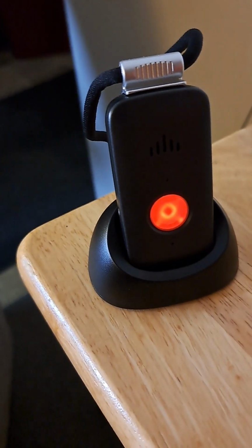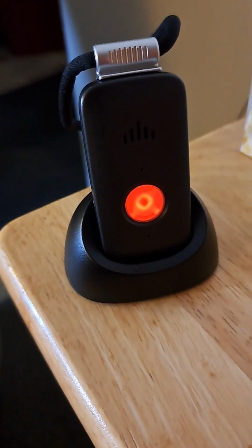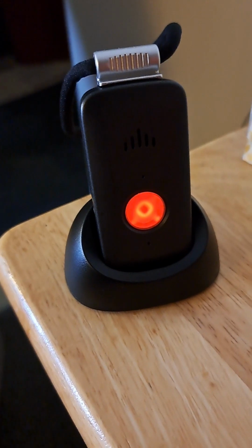Welcome back, everybody. We've had 24 hours, but it only takes 2 hours to charge a Lifeline button from empty to full. So we've had 24. So we're now going to show you what the button looks like all charged up. This is what the button looks like when it's all charged up. It is a solid orange light with an occasional blue flash in the middle to show you that it has received signal.